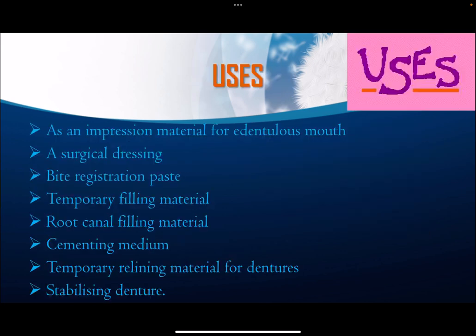Zinc oxide eugenol impression material is used as a final impression for the edentulous mouth, in surgical dressing, bite registration, temporary filling, root canal filling, cementing medium, etc. These are its additional uses.